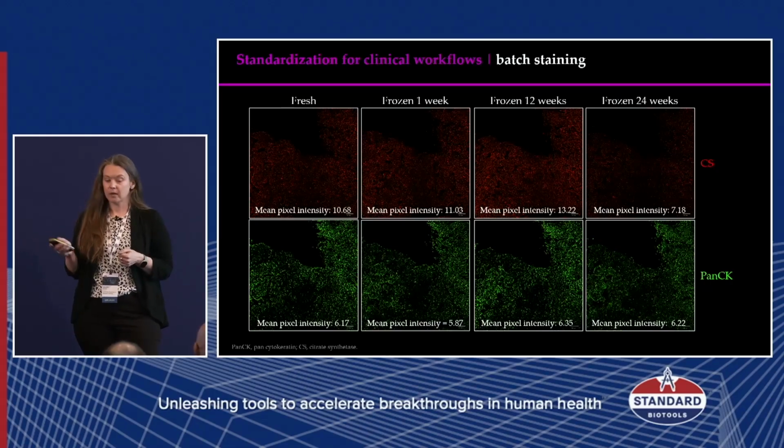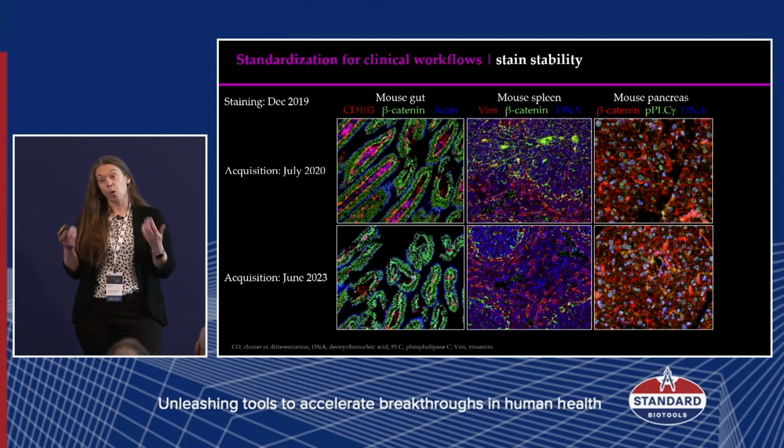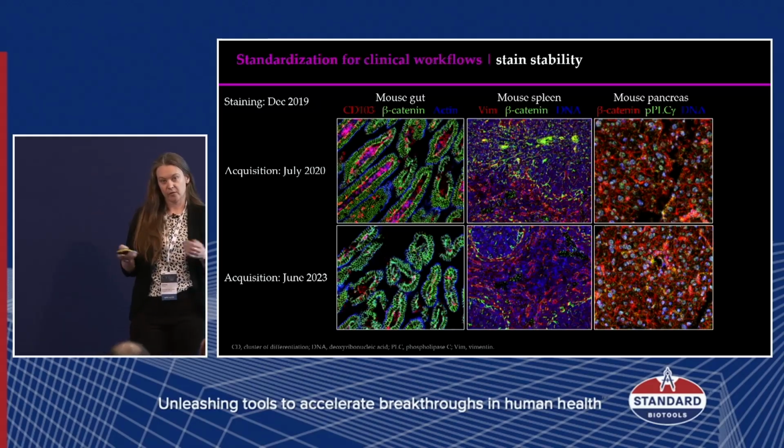And so I don't like to throw anything out. So I went through many of my slide boxes, found the oldest thing that we had in the lab, and then reacquired that. And so there's about 3 years in between these two acquisitions, but you can see that the staining quality remains excellent on these slides. I like to say that they were well cared for during those 3 years, but in reality, they've just been thrown around my desk for 3 years. And so even without being well cared for, we still see that nice stain stability.